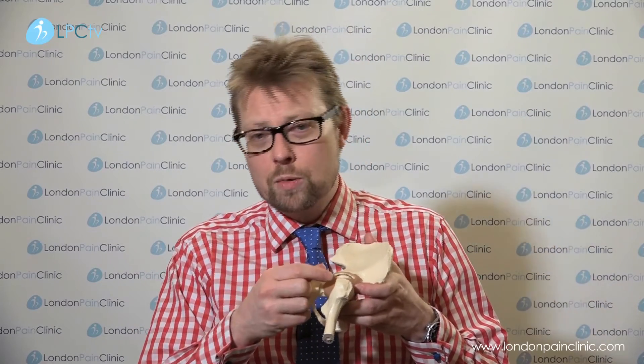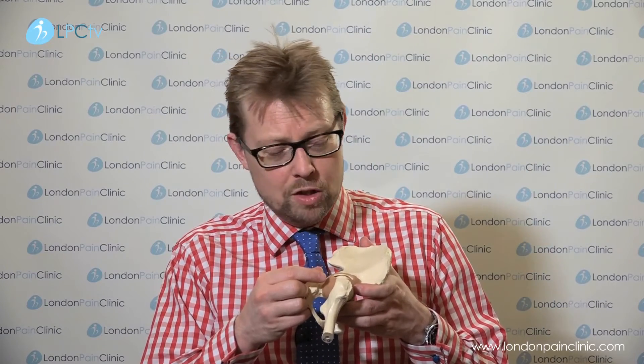Basically, under ultrasound or X-ray, we will identify the hip joint. We will put a needle inside the hip joint, and once we're satisfied that we're right in the middle of the joint, we will inject the visco-supplement, which is this jelly-like substance.